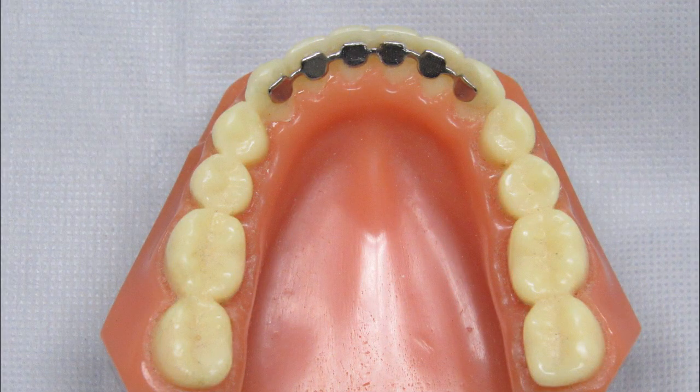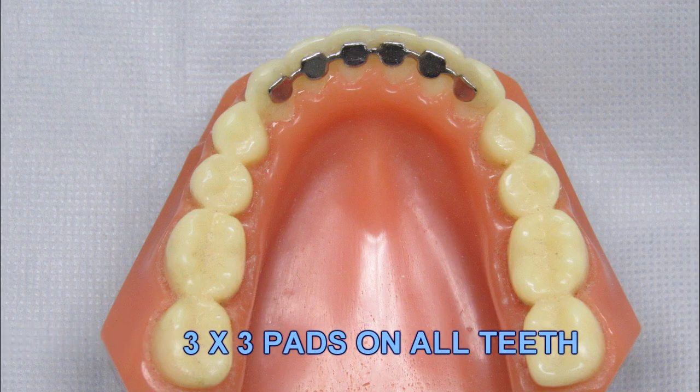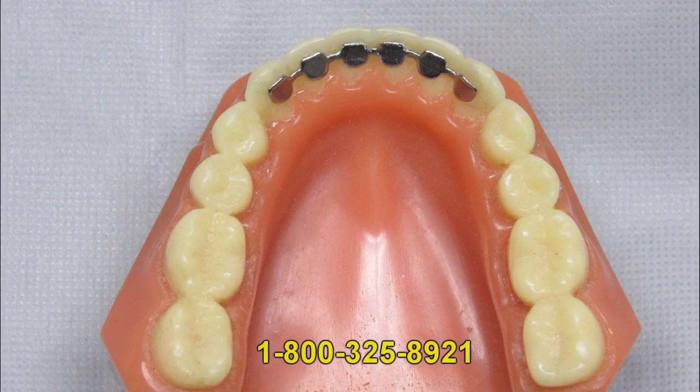For maximum retention on the largest bonding surface, this 3x3 retainer with bonding pads on each individual tooth is recommended. The pads are similar to a bracket pad and the wire is flatter. The wire and pads are a lower profile than the traditional 3x3 retainer — it is more like a cast bar. This version is recommended for severely rotated teeth; it will hold them in their new position much better and the larger bonding surface area will resist relapse tendencies and control rotations. This retainer can be a little more difficult to brush and floss around. Please be sure to send a lower model if you want us to fabricate this retainer on the upper arch.